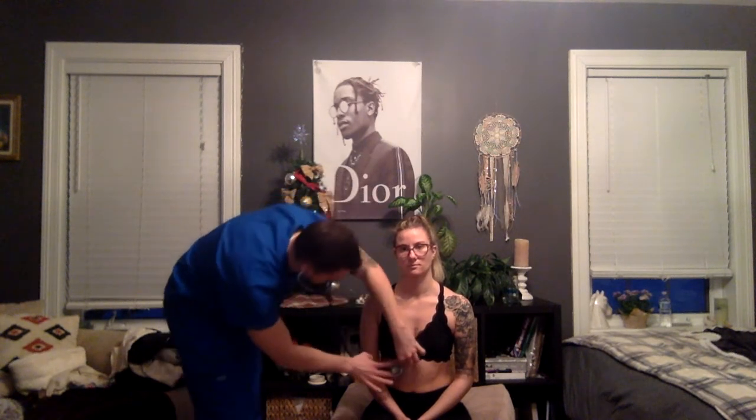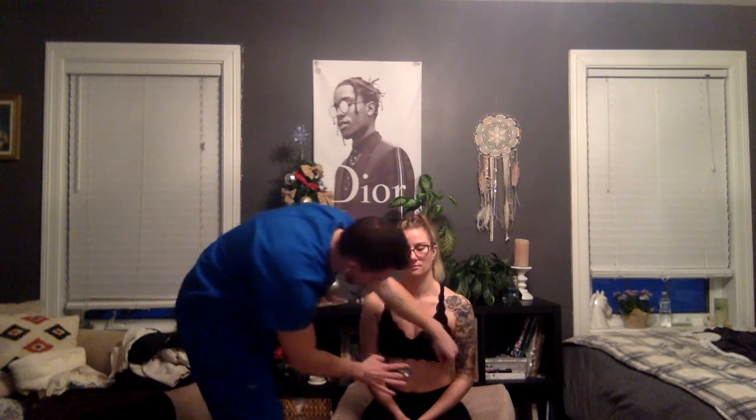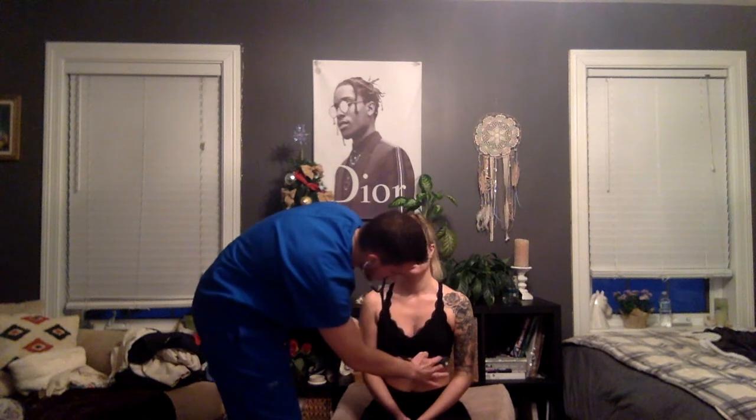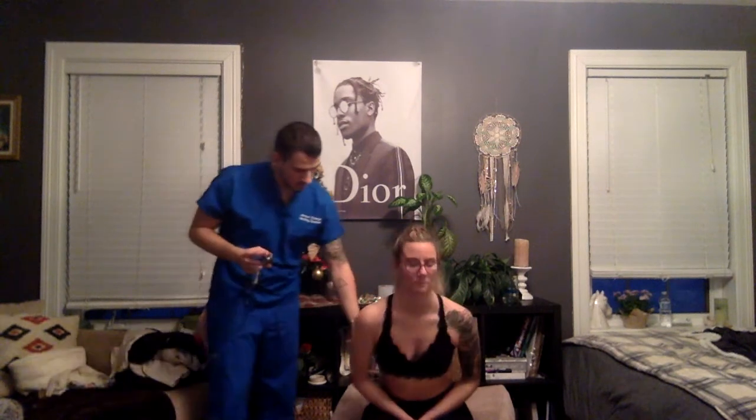Okay. And then right here. Return. Okay, and all of the breath sounds are clear and normal. I don't hear any crackles or anything like that. So now I'm going to auscultate the right side of the patient's lungs.